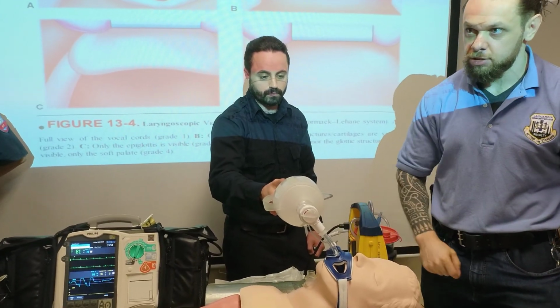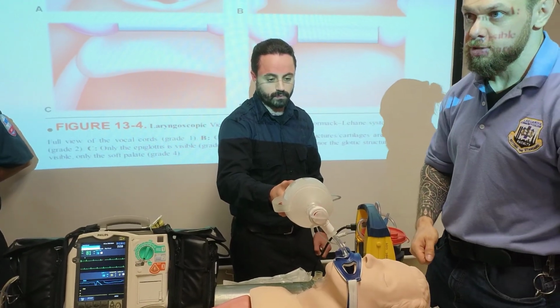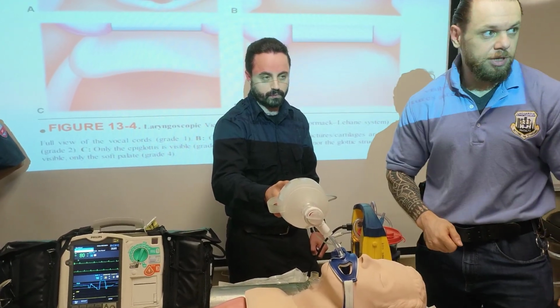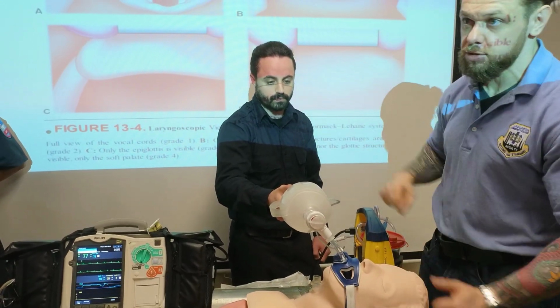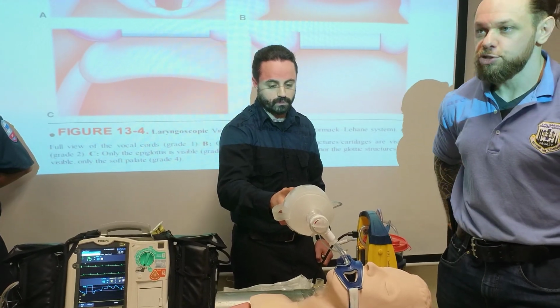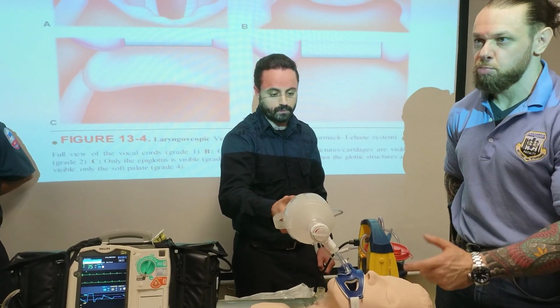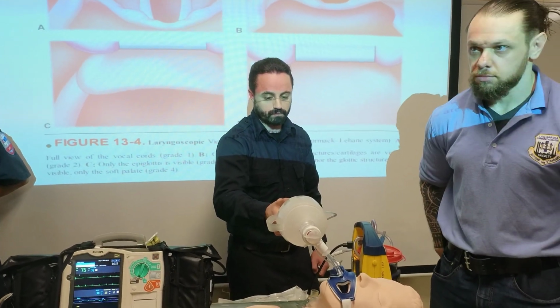You know what the ER does first? You bring a patient like this in, and the doctor takes his laryngoscope. He checks where the tube is. Any hospital you bring it to, the ER takes their video laryngoscope and checks where the tube is. They want to make sure it's in the vocal cords. And if it's not, it's on you. You can lose your certifications for this. There's doctors actively putting out studies to take away this skill from you. So you want to make sure everything is right.